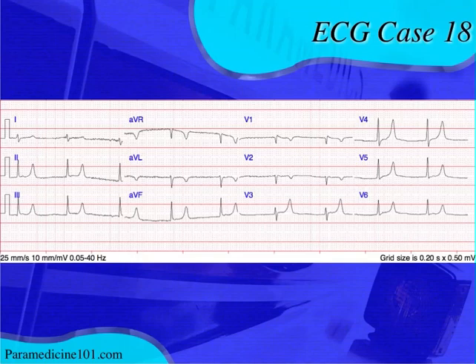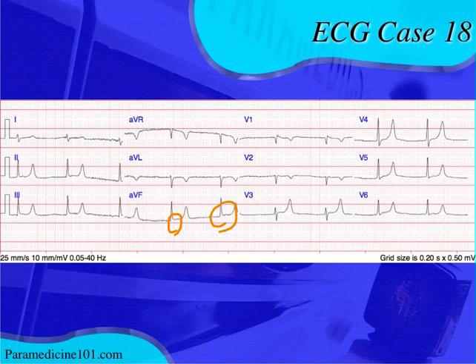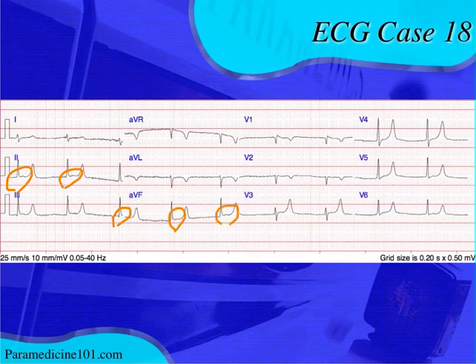Taking a look again at this rhythm — I do see P waves, they're just not before the QRS. Whenever you don't see a P, look at the T wave and look for P waves hidden in the T waves. These appear just before the T wave — I believe in that ST segment. You see that little positive blip? You only really see it in AVF and maybe a little bit in lead II. That lets you know it's retrograde. It's in the same spot after every QRS complex, so we're not thinking complete heart block. The PR interval is too long — in fact the T wave is between the P wave and the QRS — so you're not going to call that a first-degree AV block.